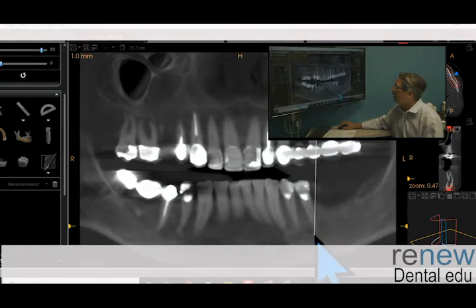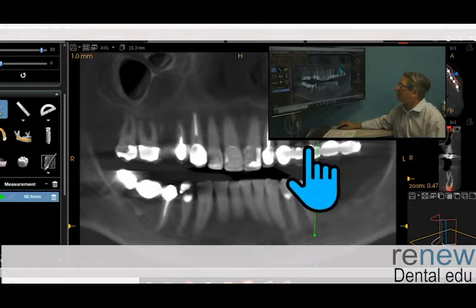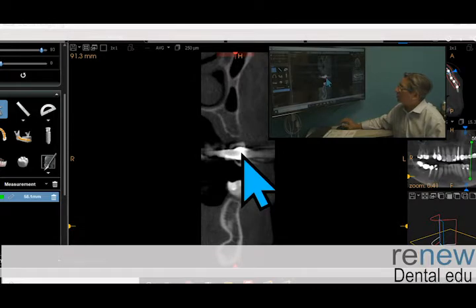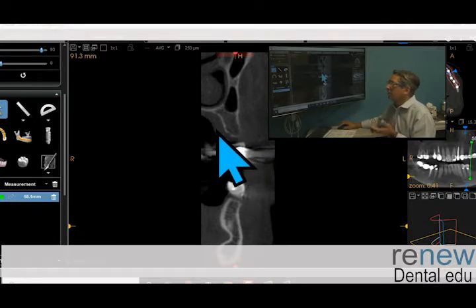So if I could get back something here to here, then I'm good. So let's look at that site. So you would graft this site, and then on this site, the bone density is poor as well, and so you're going to have to do compression. And the reason why I say it's poor is because the grayscale is showing me that it's very similar in density to the tissue outside of it, which tells me that's not a lot. As much as you see the gray here, don't be fooled. This is just a density measurement, and if your density measurement of your palate tissue looks exactly the same as the density measurement of the bone, you got a problem.